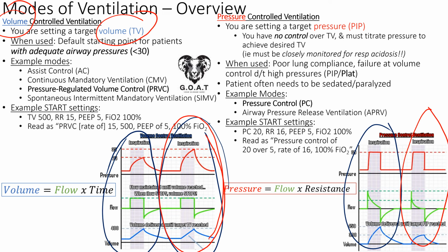It didn't require a lot of pressure to deliver. You can say, hey, that tidal volume we're giving them is causing the pressures to get high. But how do you know that's the right tidal volume for them?